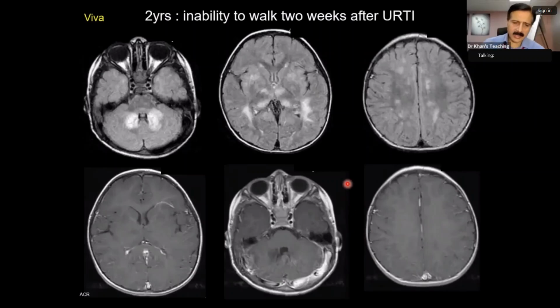Right. So, acute disseminated encephalomyelitis is a monophasic illness in which, as we discussed previously, the white matter abnormalities will be slightly larger or confluent as compared to punctate lesions, which are usually seen in MS. But MS can also present with larger lesions. One of the key exam points to remember is that other than white matter, at times, deep gray matter is also involved. So remember this. This is an exam point in ADEM. Not in each and every case, but sometimes it is.